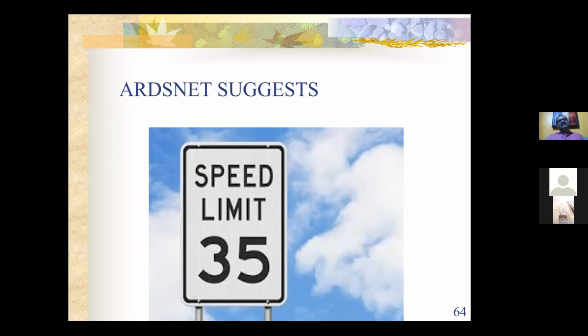We usually keep a rate of around 12 to 20 in many patients, especially in COPD. When there is a problem with hypercarbia, we have to keep a lower rate, maybe 14 to 16 or less, so that you get more expiratory time for the carbon dioxide to go out. But in ARDS, where hypoxia is the main issue, we can accept permissive hypercapnia, but we have to keep a higher rate so that we can achieve adequate minute ventilation.